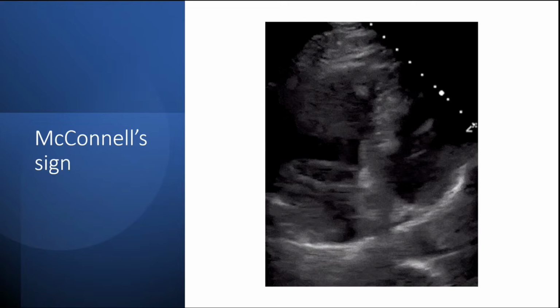Second, the right ventricle may be assuming a more spherical shape to equalize regional wall stress when subject to an abrupt increase in afterload due to PE. And third, there may also be localized ischemia of the right ventricular free wall as a result of increased wall stress, and all this leads to akinesis of the RV lateral wall with a hyperdynamic apex.